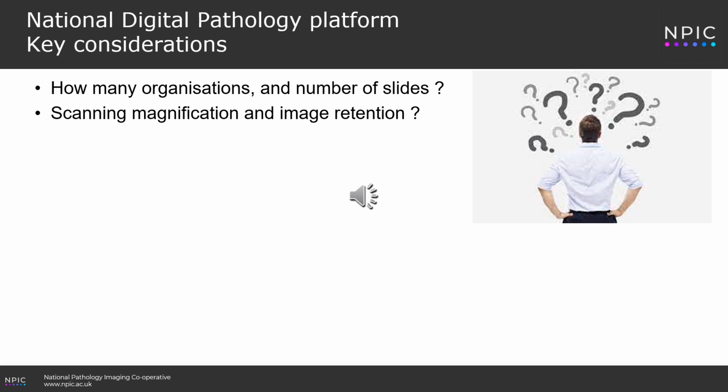I have also had many questions about how long we will keep the digital image for. Some deployments, again, in order to save storage costs, will only keep images for a matter of months. The Royal College guidelines recommend keeping images for 2 lab inspection cycles.